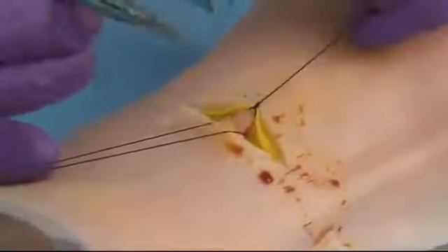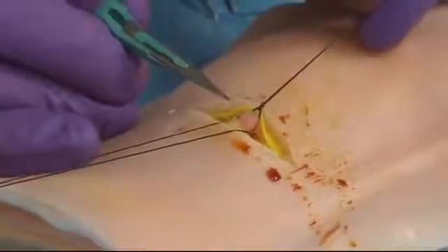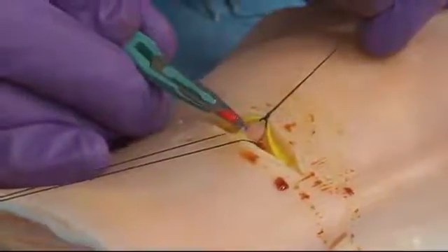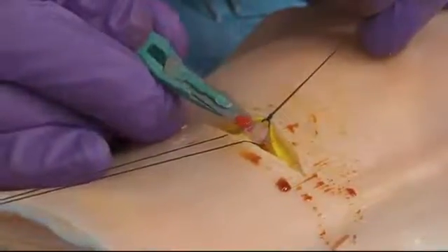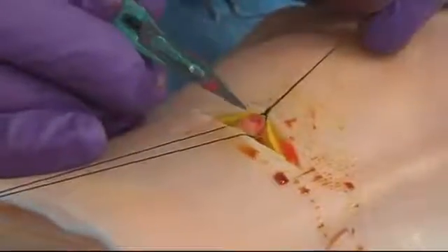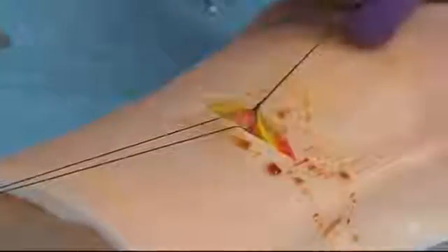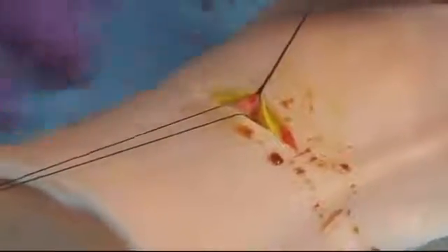Let's do that on the vessel. At this point it's useful to have an assistant who can hold on to the suture for you on your vessel. I'm going to grab the other end of this and bring the vessel up into my field. Now I'm going to place the 11 blade perpendicular to the vessel through and through to the other side and then angle it up and away. Now you see I've raised a bit of a flap there, and through this flap I can now place my angiocath.